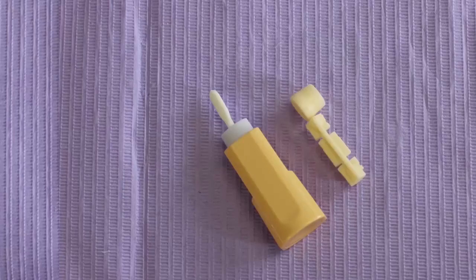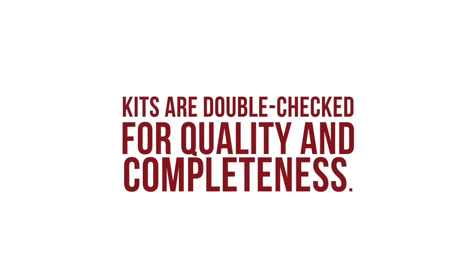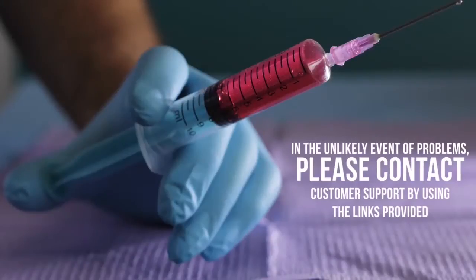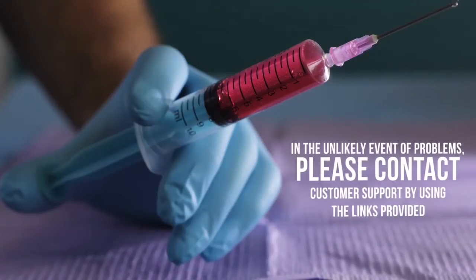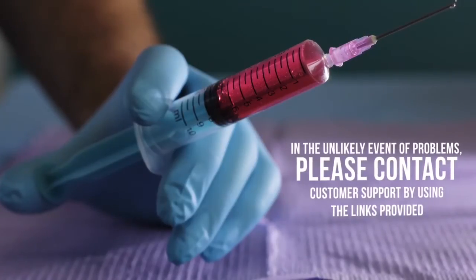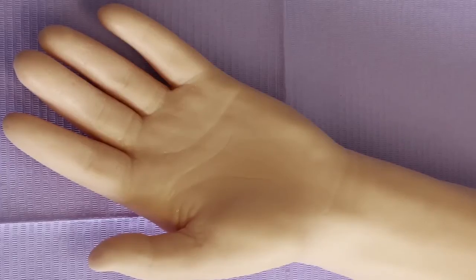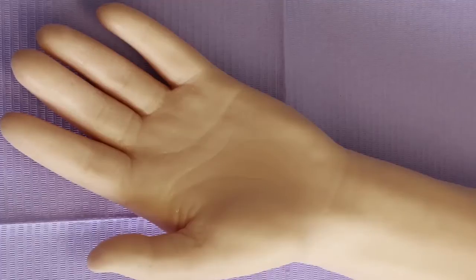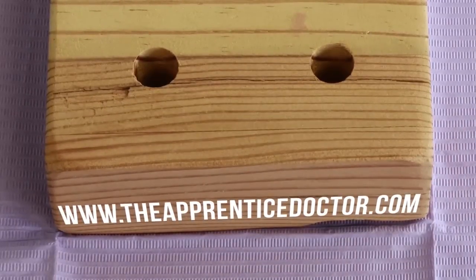Keep in mind that contents may differ slightly from the list depending on the availability of items. Kits are double checked for quality and completeness. In the unlikely event of problems, please contact customer support by using the links provided. Additional items like an anatomical simulation arm or a blood tube stand may be ordered from the online shop at our website.